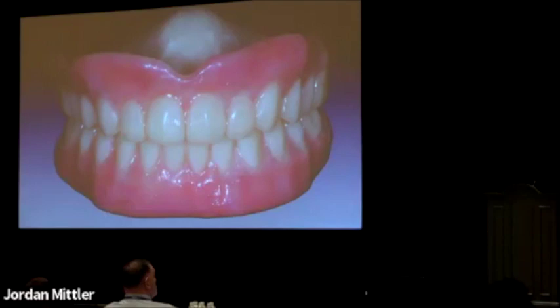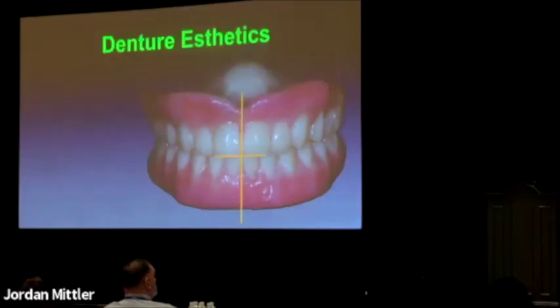These were full dentures. There's nothing under them, no attachments, no holes in them at this point, and they work quite well. And sort of hearkening back to what I said before, denture aesthetics are the most important part here. This is going to dictate where our incisal edge position needs to be, and all of that then dictates where the implant position needs to be. As soon as we know our 2 central incisors or maybe our anterior 6 teeth, everything else is going to fall into place. And so now we can take this information.